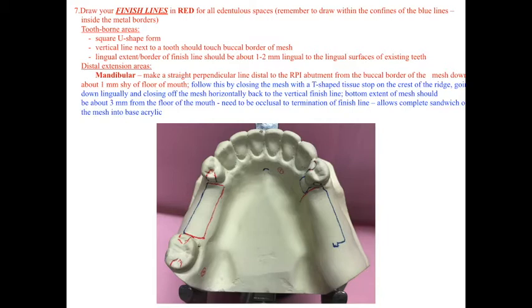Why do we need that? When we lose a tooth, the bone will continue to resorb forever, so you might need to do a reline a couple of years later. However, we are not able to reline the metal surface. We can only reline the denture-base material area. That's why we want this part. Eventually, when we finish, the denture base touches the tissue, not the framework. You only have this tiny tissue stop touching.